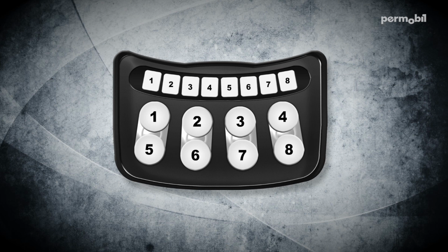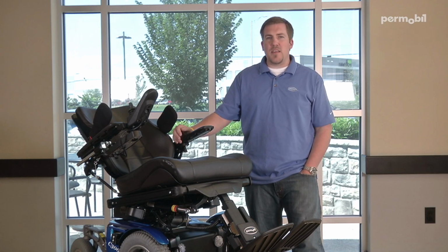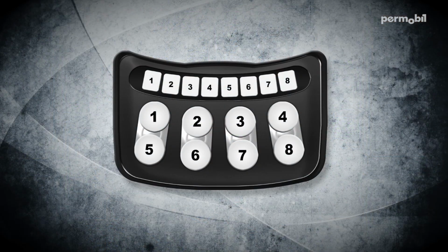When programming memory into the wheelchair's system, you're going to be using the ICS switchbox to perform this process. It's important to understand how the layout of the ICS switchbox works. The ICS switchbox consists of 8 LEDs across the top that are numbered 1 through 8 from the left to the right. It also consists of 8 buttons. The buttons are numbered the way that a book reads, 1 through 4 across the top row, and buttons 5 through 8 across the bottom row.